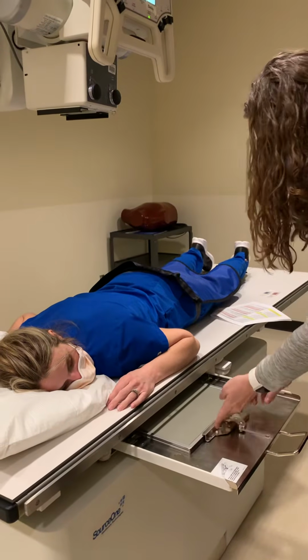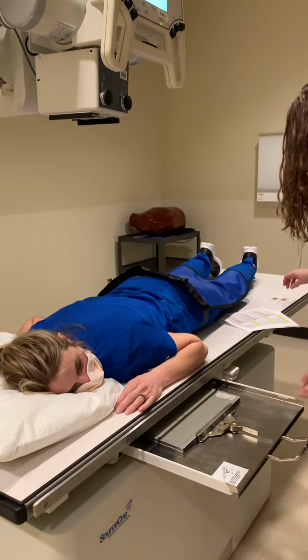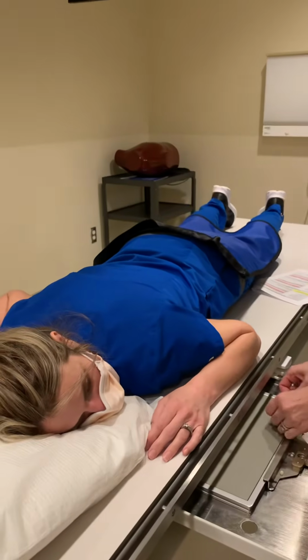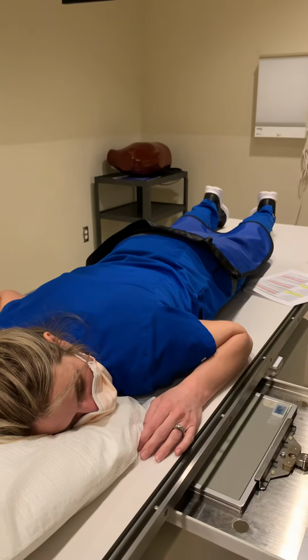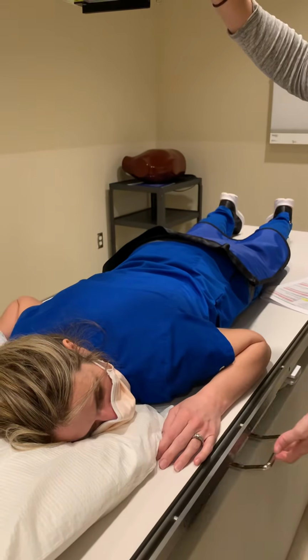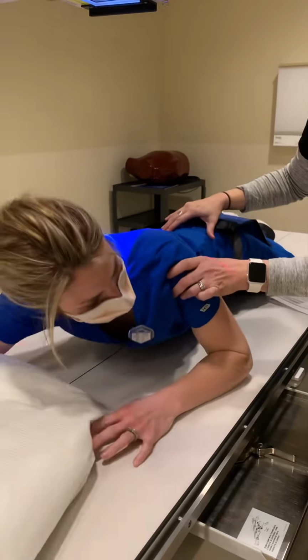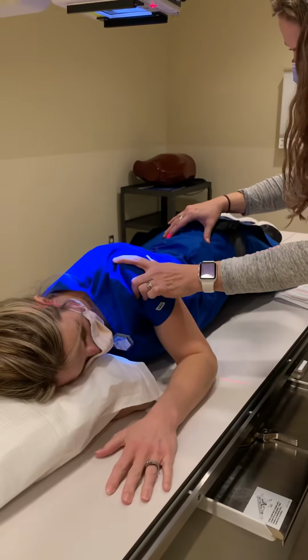Today we're demonstrating PA oblique RAO stomach. Patient is prone. We're placing a 10 by 12 lengthwise in the bucky with a left marker in the lower left corner. Central ray is perpendicular.